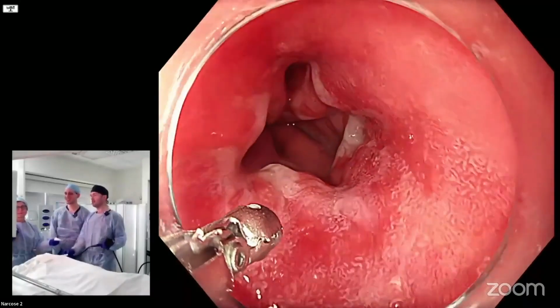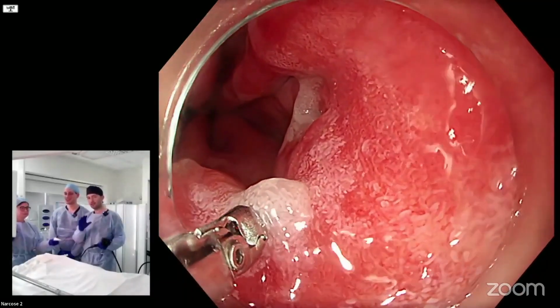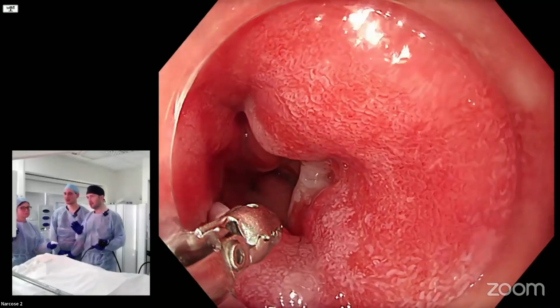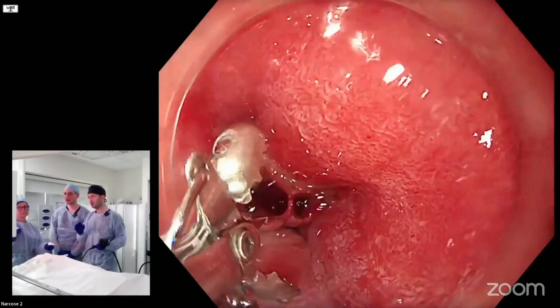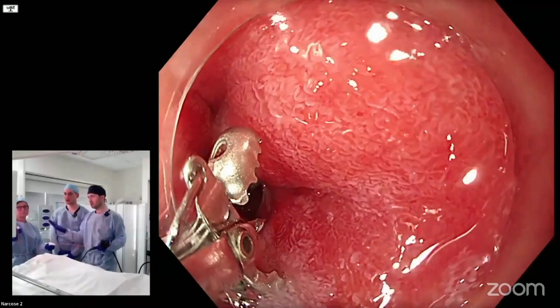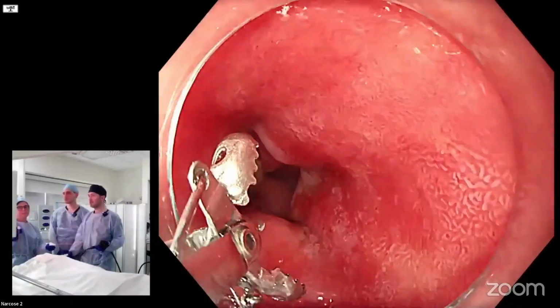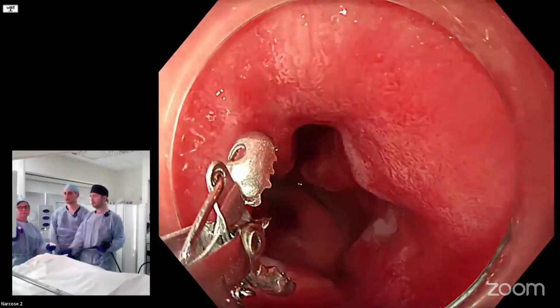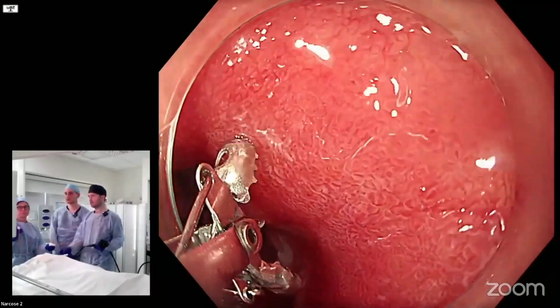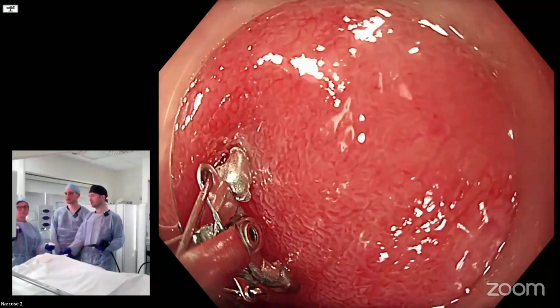Okay, biopsy technique in the esophagus. I'm actually going to biopsy that zone, right? So you want two techniques. One technique is for when I want to biopsy something focused. That technique is as follows. You open the biopsy forceps. If you think that what you want to biopsy is smaller than this, you close a bit, but we're not doing that. We're just going to biopsy a big piece of esophageal mucosa, right? So the technique for that is find the target. Okay, so I'm still in target seeking mode. I need to find this kind of area, right? Then, okay, this is going to get a superficial biopsy, okay?